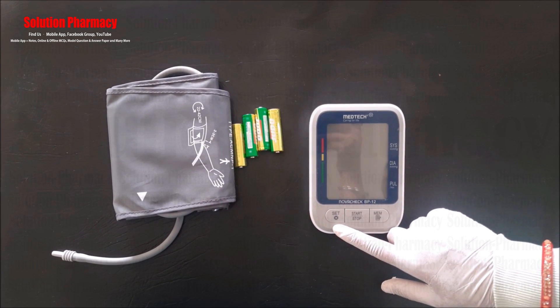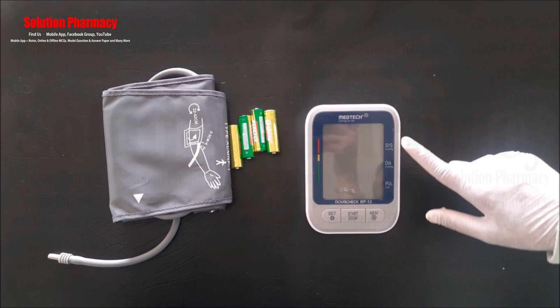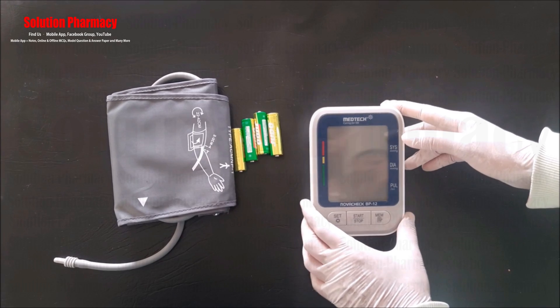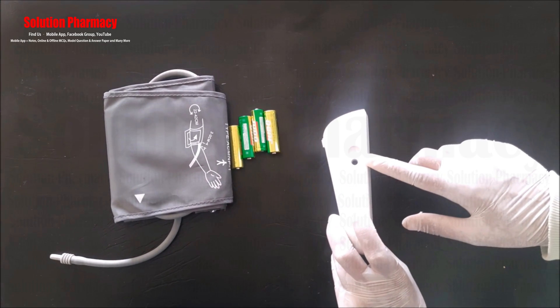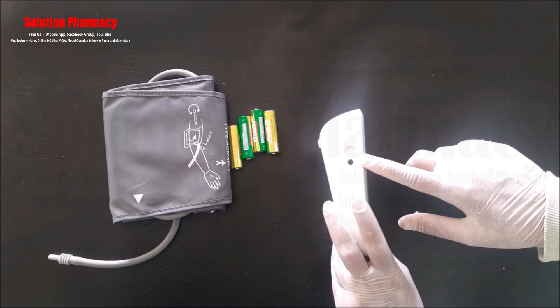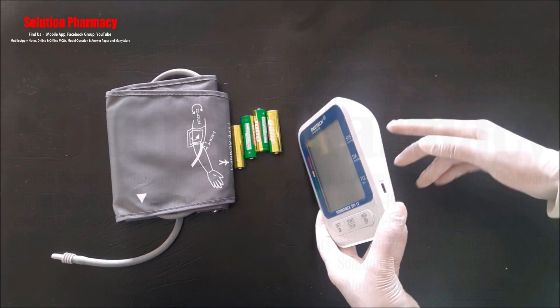This is the set button, this is the start/stop button, and this is the mem button — the memory button. This is the LCD display where the systolic, diastolic, and pulse rate will be displayed after the measurement. This is the cuff connector where we connect the cuff at the time of measurement.